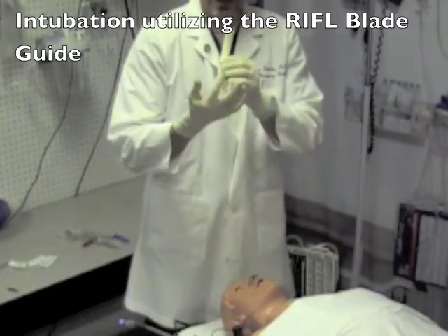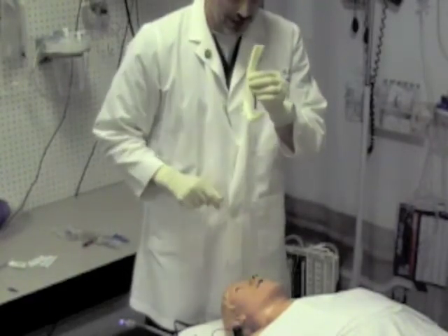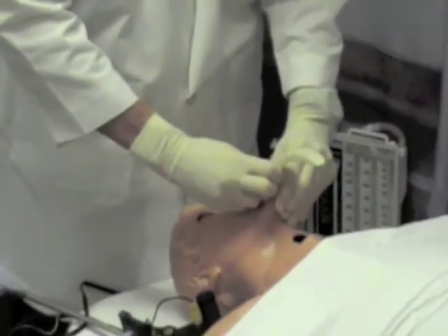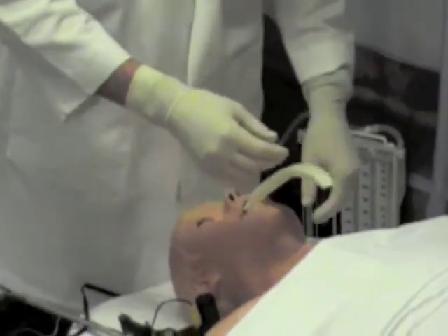The Rifle blade is made with an integrated channel that allows you to pass the scope and endotracheal tube easily. You will place the rifle blade guide into the patient's mouth midline, similar to how you would place a standard laryngoscope.